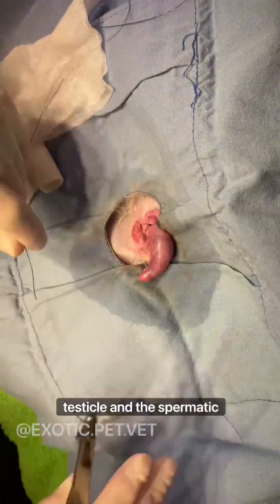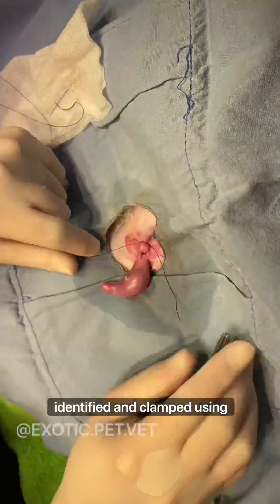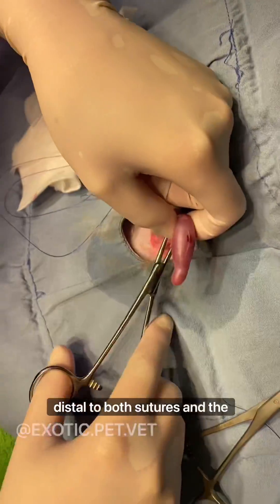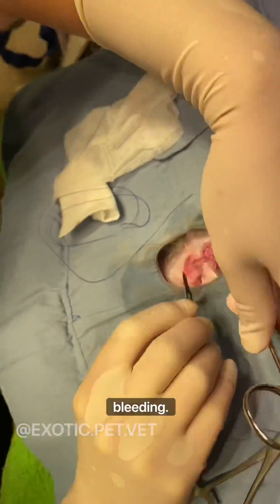The separation between the testicle and the spermatic cord, which includes the blood vessels and the vas deferens, is identified and clamped using mosquito forceps. The testicle is then transected distal to both sutures and the remaining pedicle is released back into the inguinal canal after checking for bleeding.